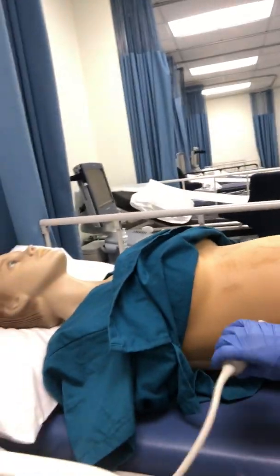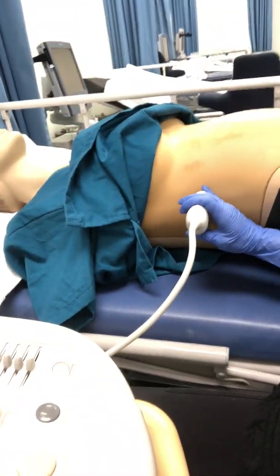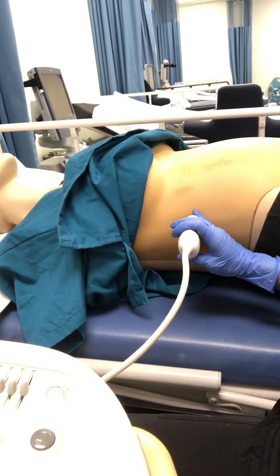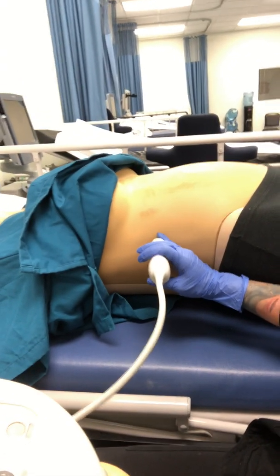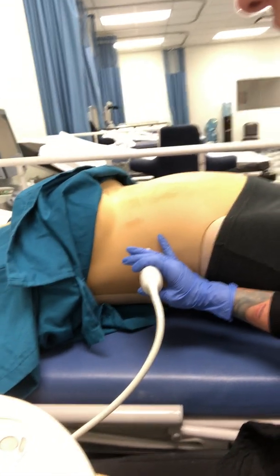So again, wherever your notch is pointing, you have to figure out where your notch is pointing first, and then the right-hand side of your screen is essentially going to be the exact opposite of that. So if your notch or your left-hand side of the screen is pointing posterior, then you can just assume that the other aspect of the probe or the right-hand side of the screen is going to be anterior.